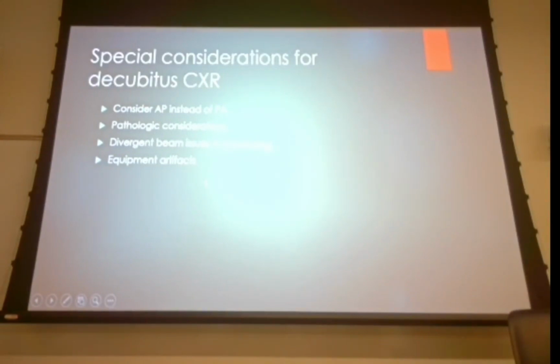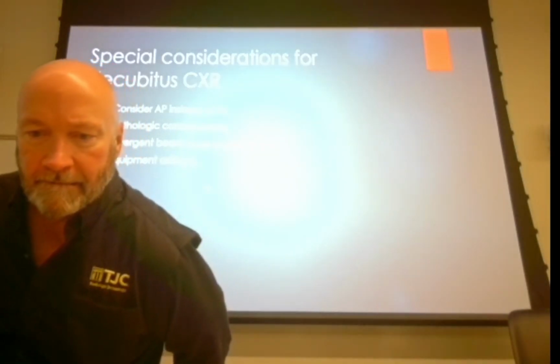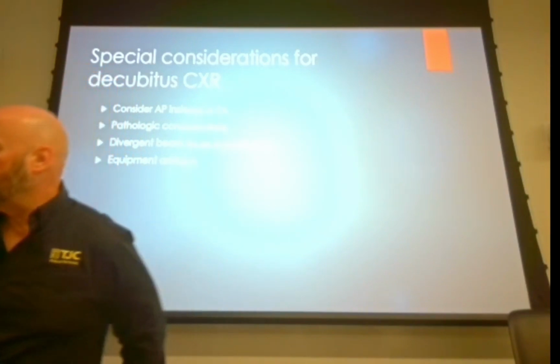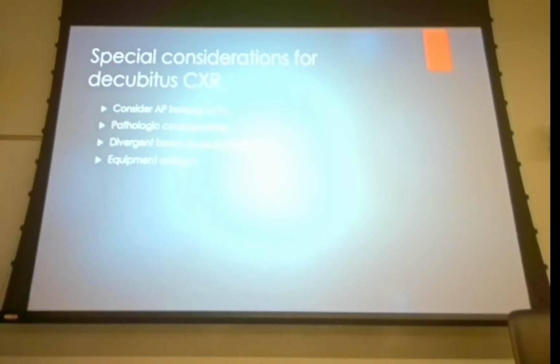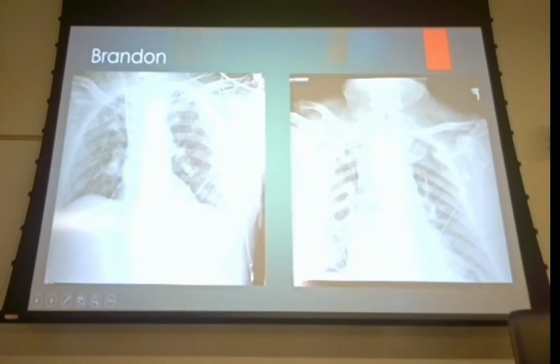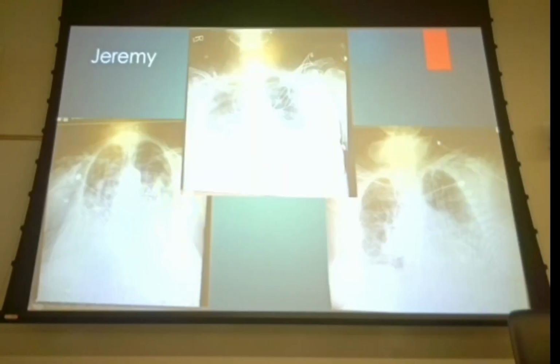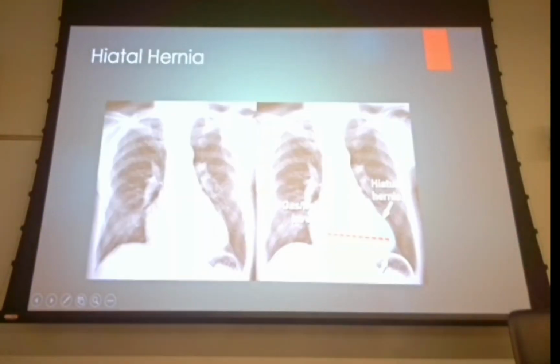all right, so what's our time? I didn't look at the time before I got started here. We're right at an hour. You know what, let's just take a look at some more x-rays and kind of assess them.